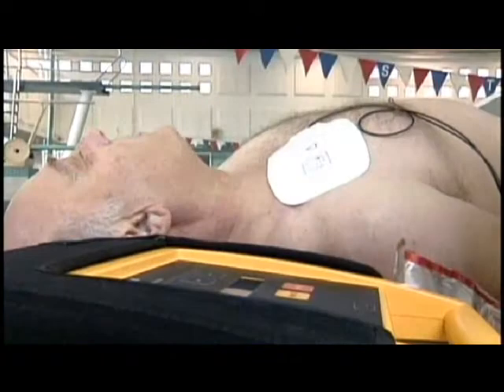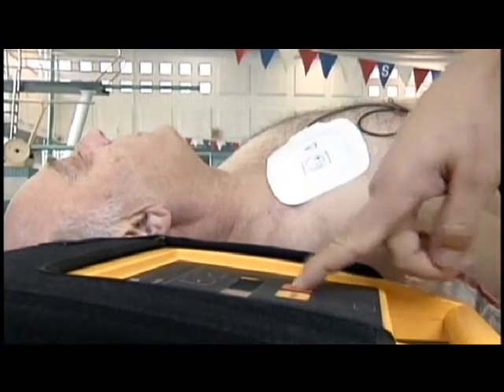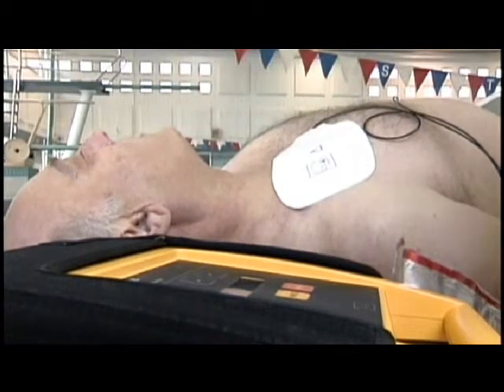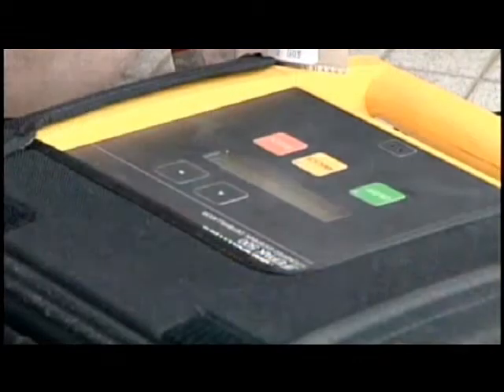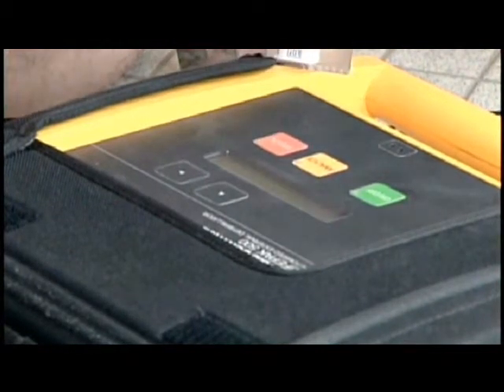No harm will be done by using the AED, but it would be highly unusual for a trauma victim to be saved by the device unless the cause of the trauma was originally a sudden cardiac event.